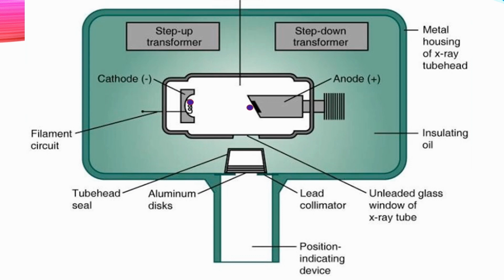When it heats up this filament, it causes the outside surface of the oxide coating to then emit electrons. Now remember, the cathode already has a negative charge, and the electrons have a negative charge. Do you think that the two negatively charged items want to hang out together? No, it's going to repel it at a really high speed. It shoots over to the positively charged anode. Opposites attract, right? So negative electrons are attracted to the positive anode. Think if you get a C on an exam, you want to shoot towards an A.